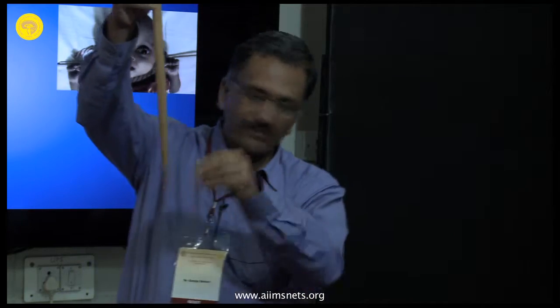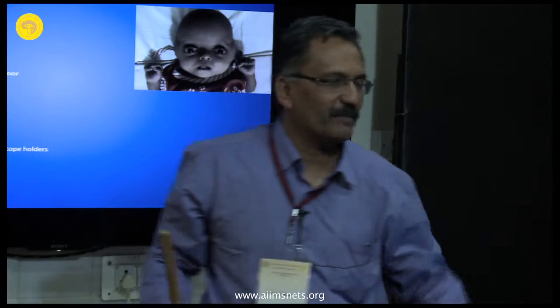So the important thing is, first of all, keep the edge of that instrument protruded a little more than your endoscope, so you're completely seeing it, you're completely watching it. Then the important thing is to touch the tumor surface and then open it. Then when you open it, you take it a little deeper into the tissue and twist it a little. And then close it and withdraw it. It's a small technique. It appears so stupid, I mean, am I talking about it? But you try it and you will understand what I'm talking about.